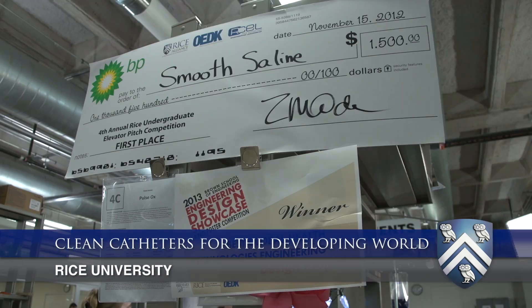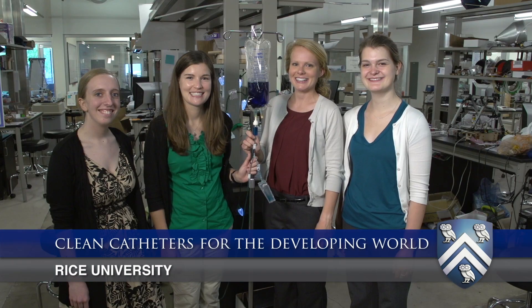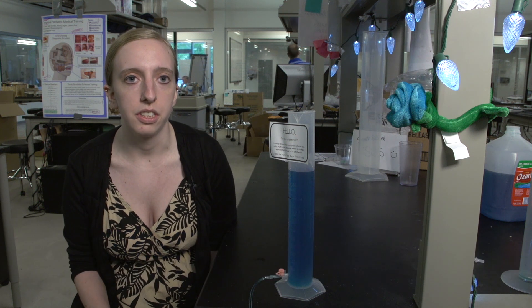Our team is Smooth Saline — you can see the pun there — and we're trying to address catheter flushing in the developing world. Right now catheter flushing is expensive due to the use of disposables and high shipping costs of U.S. manufactured products going to these countries. But if catheters are not maintained properly, you can put your patient at risk of some really serious infections.